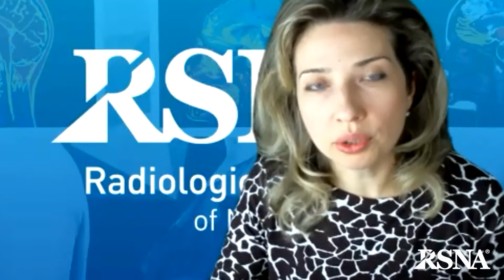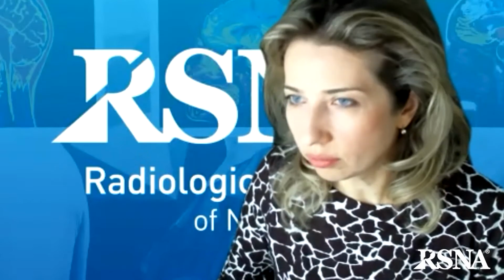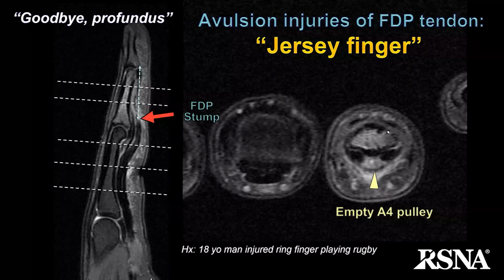So it's important to image enough, to have your imaging area sufficient to make the diagnosis. So for example, we discussed the closed avulsion injuries of the flexor digitorum profundus, the so-called jersey finger, and it has a great possibility for retraction. And the size of the gap is the critical information for the surgical planning.